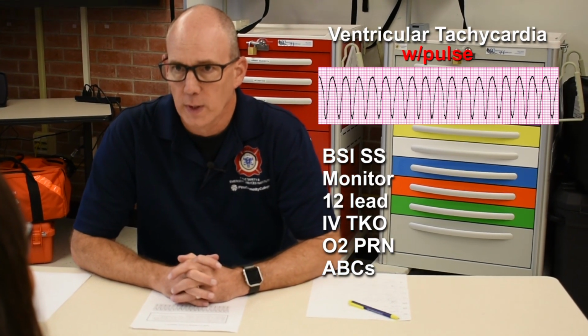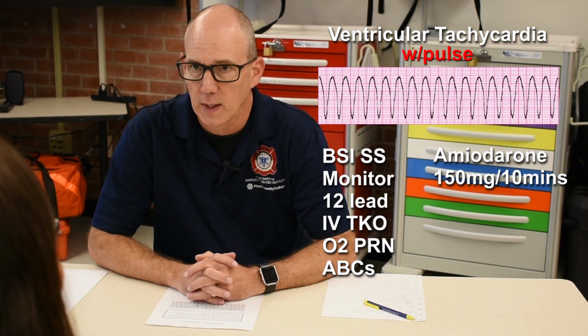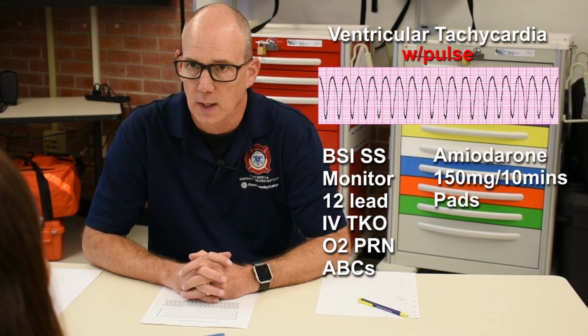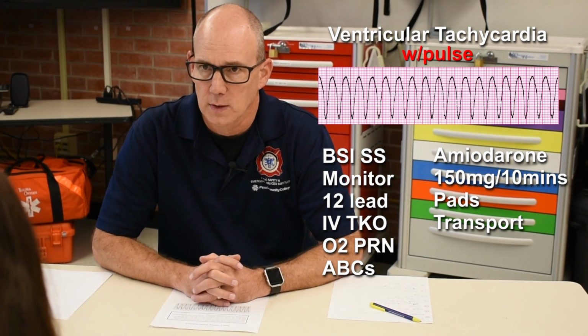Because of this patient's rhythm, I'm going to administer amiodarone 150 milligrams given over 10 minutes. I'm going to place the pads on the patient in case her condition deteriorates and I need to use electricity. I'm going to transport the patient to the hospital and reassess en route.